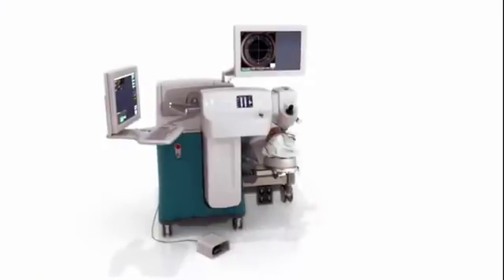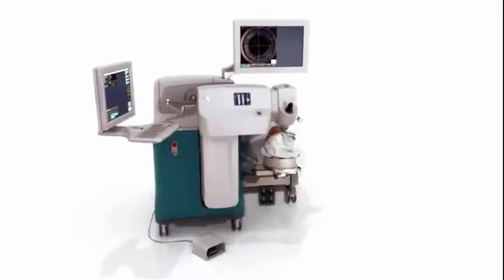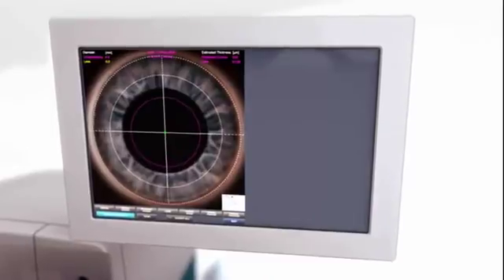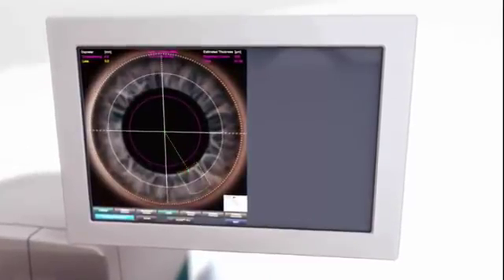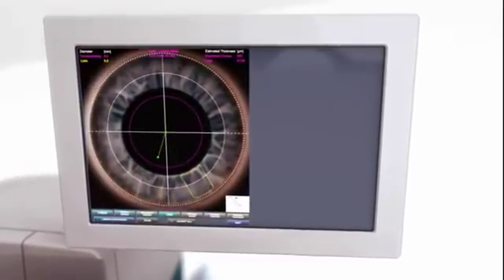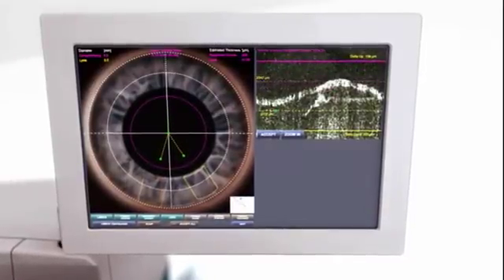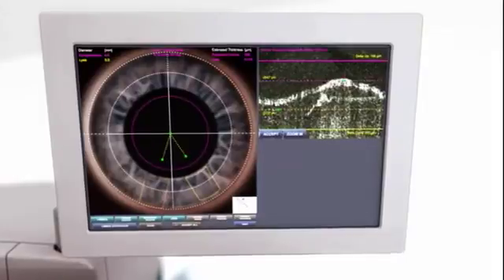The LensX laser brings a new level of customization to cataract surgery, allowing each procedure to be specifically tailored to patient anatomy and surgeon preference. The video microscope allows the surgeon to use the patient's eye as a visual reference when programming the laser's settings.